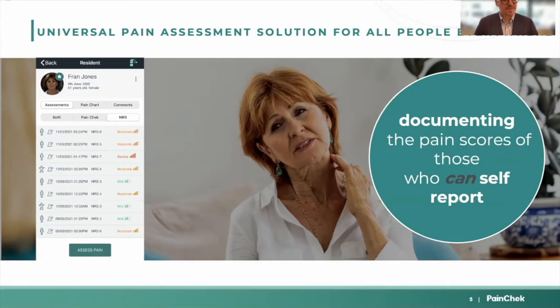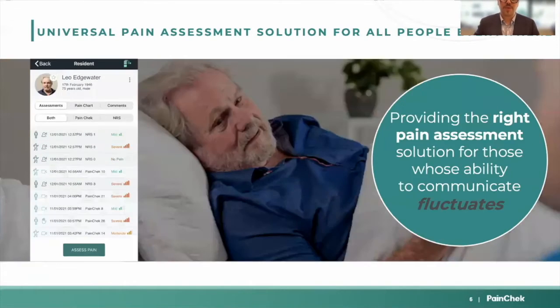Open the PainChek app, select your resident, and assess or document the self-report of that resident. This then gets underscored for those who fluctuate in terms of cognitive state. Some of your residents are always going to require an observational assessment due to a long-standing cognitive impairment. Some may require care just for purely physical reasons and are cognitively sound. They'll always be able to self-report.